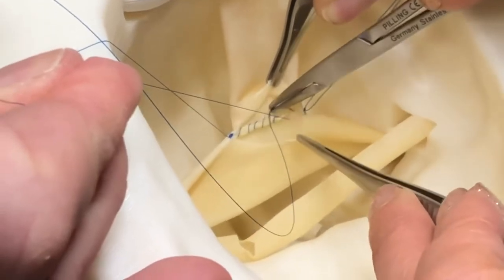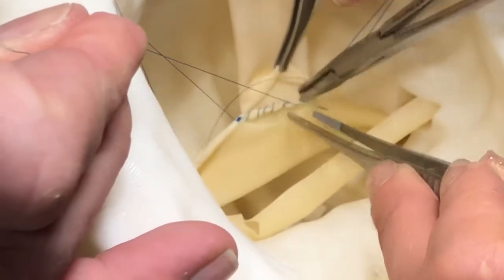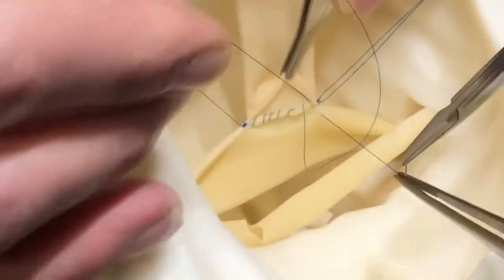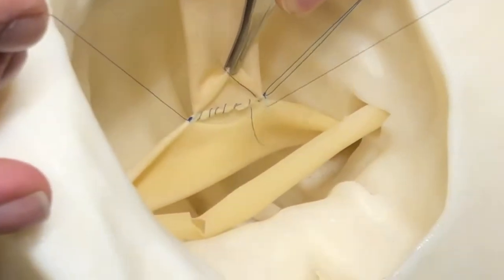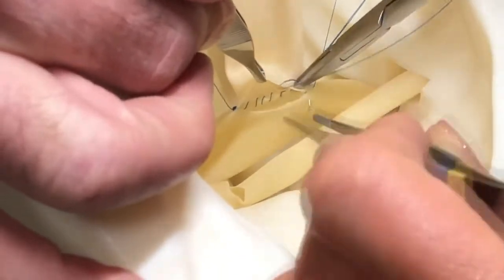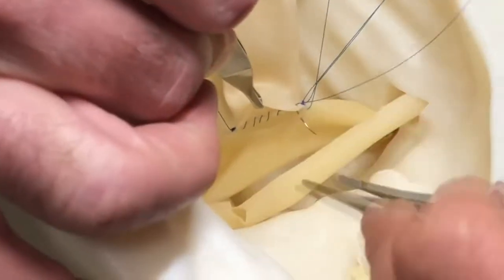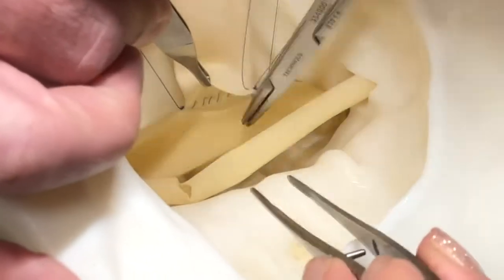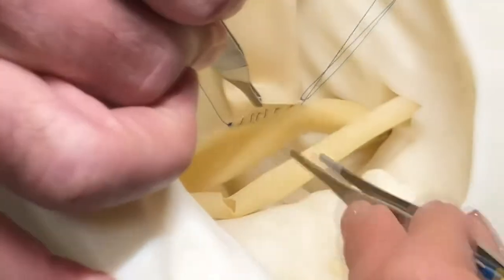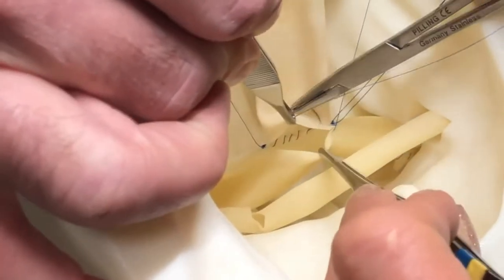If the vein is friable, adding a couple of millimeters to each bite can also help things hold together. The transition from the back wall to the front wall is what we call the triple stitch. The back wall stitch is then continued along to exit out of the front wall of the iliac vein, allowing the surgeon to continue with a forehand anastomosis along the anterior portion.